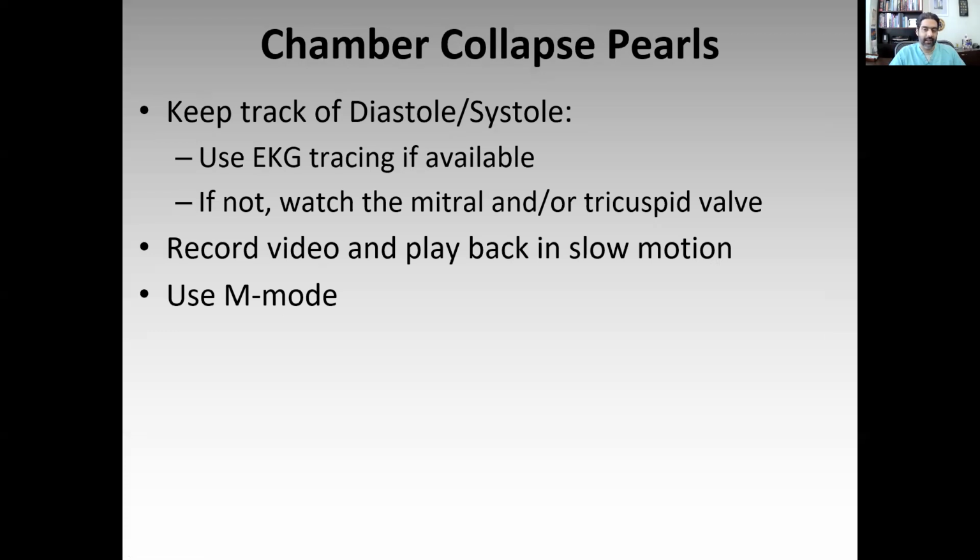And like I said, you can either record a video and play it back in slow motion or frame by frame, or you can just put M-mode down through your objects of interest and look at their motion over time.